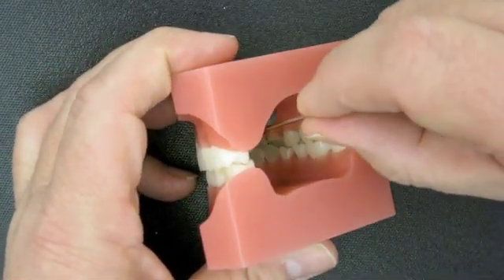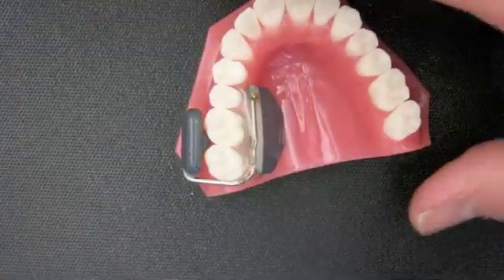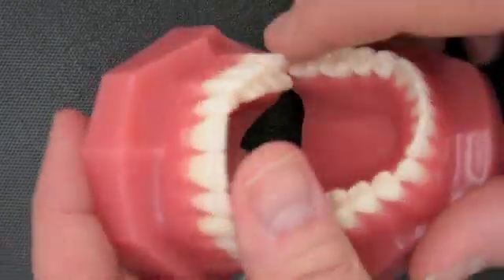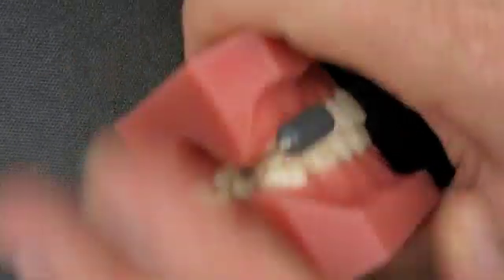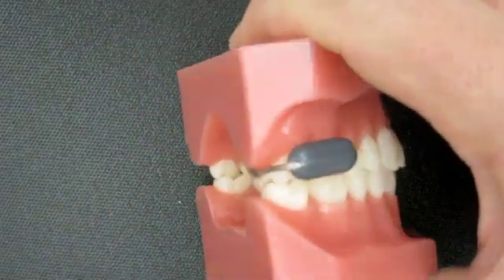Here's the battery being placed with the models together, and you can see again how much space we need for that wire. Here's a nice fitting ITM on a model, and it fits nicely. It should be out of occlusion, but again, it's very much dependent on the patient.